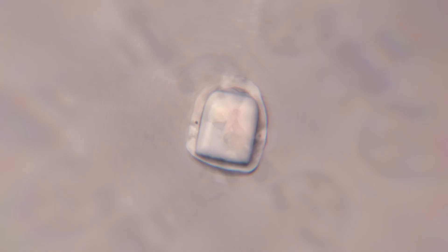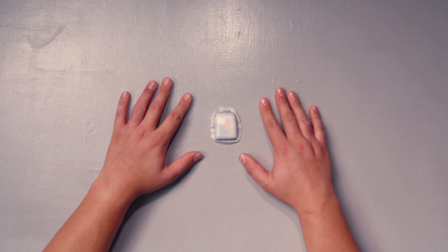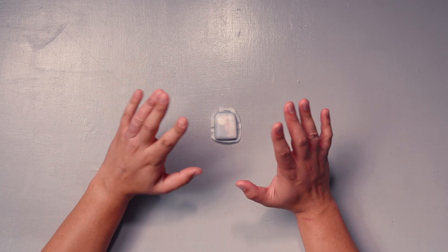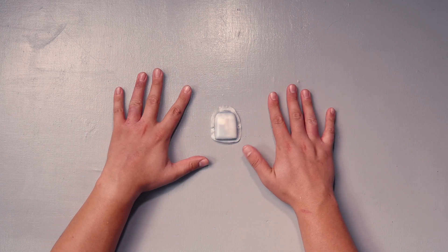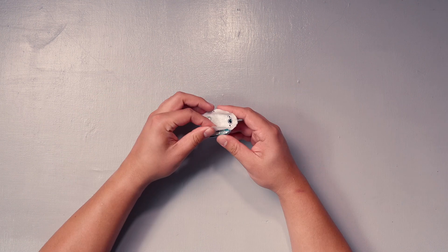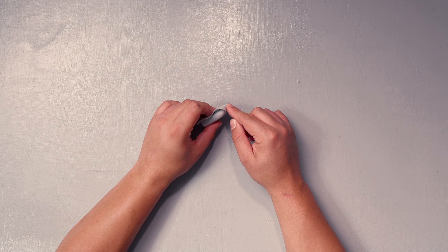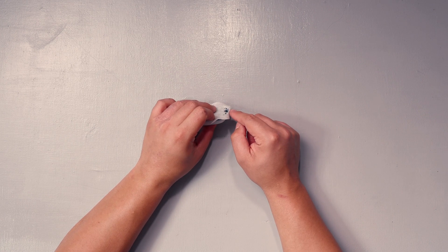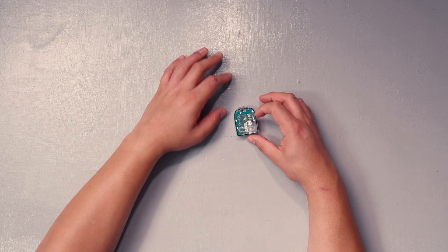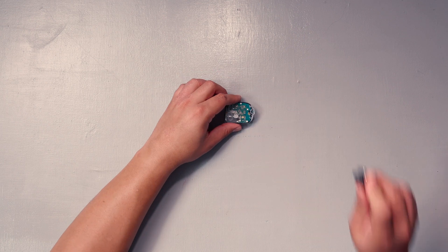We're gonna go ahead and take apart one of these bad boys and look for all the parts I just mentioned. Here's the pod, and I'll say right off the bat — this is one that's already expired, already been used, so we're not wasting one. I can see the adhesive, and that's the tube that gets inserted into the body — the needle goes through and leaves that behind. This is obviously like the motherboard that tells everything what to do.